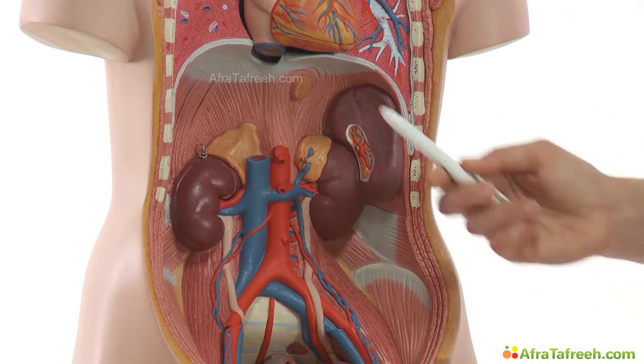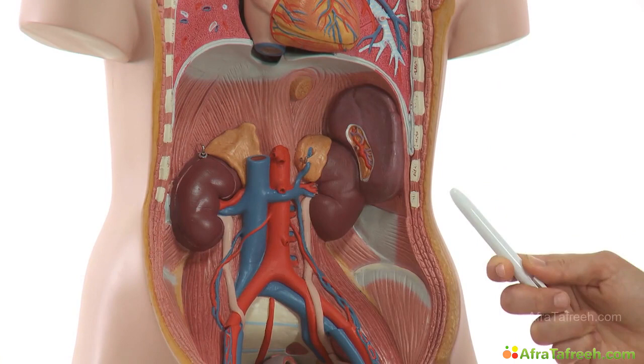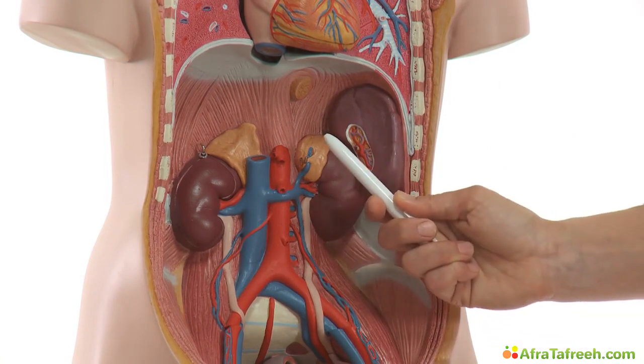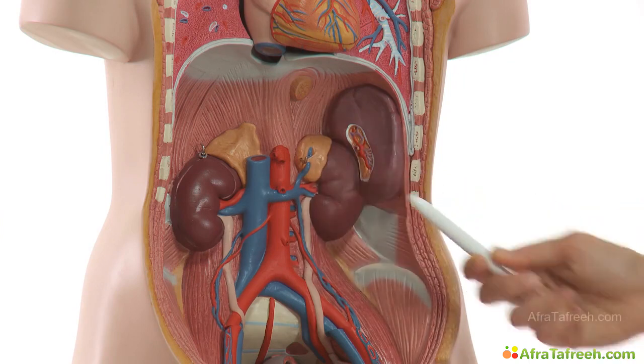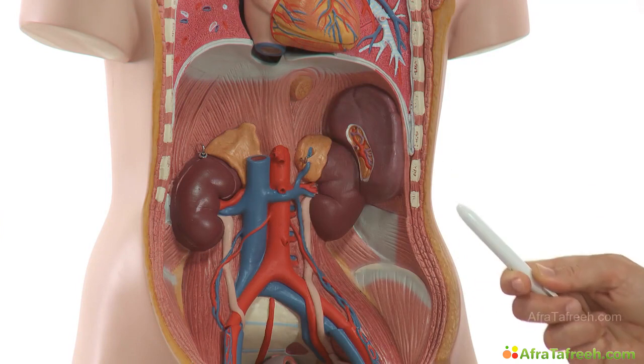So we got both adrenal glands, the right one and the left one, in the retroperitoneal space. And as you can easily see, they are not only superiorly, but also medially of both our kidneys.